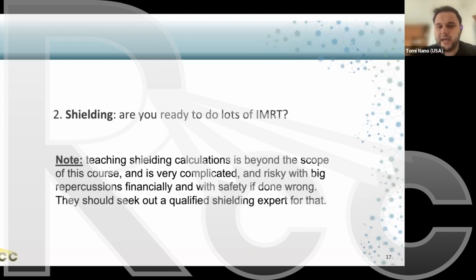So if you don't have opposed beams, then you don't have the summation of the exit dose from both of the beams adding up in the same area. So maybe instead of odd, maybe staggered beam orientations so that the exit of one beam doesn't add to the entrance dose of another beam. That makes a lot of sense. Yeah.